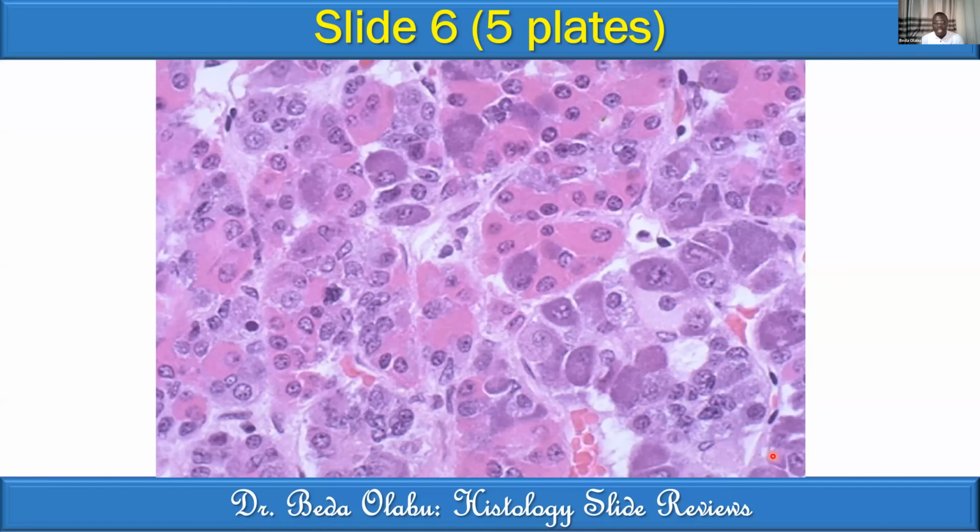There are three cell types of the adenohypophysis. That one, the one that doesn't take up stain, chromophobes. So that's a chromophobe. Then the ones which take that pinkish stain, those are acidophils.